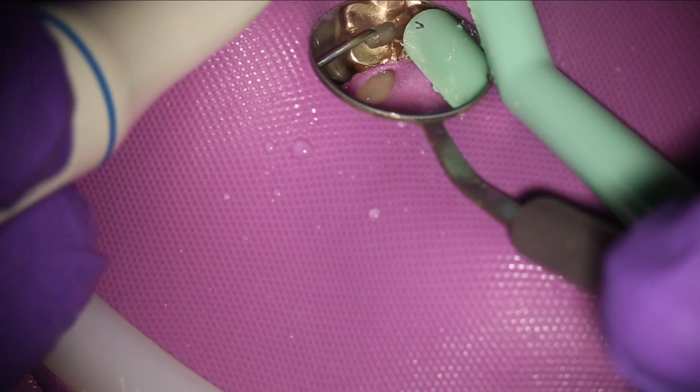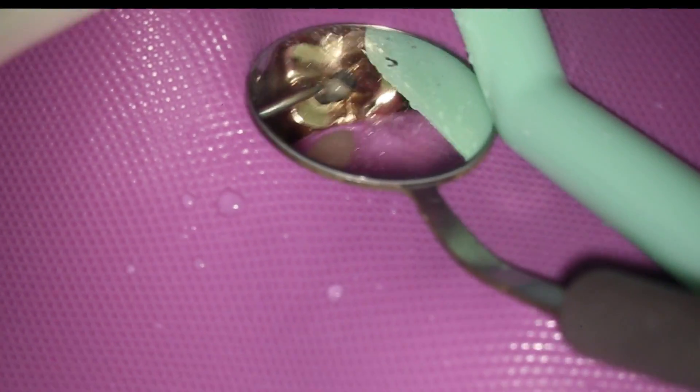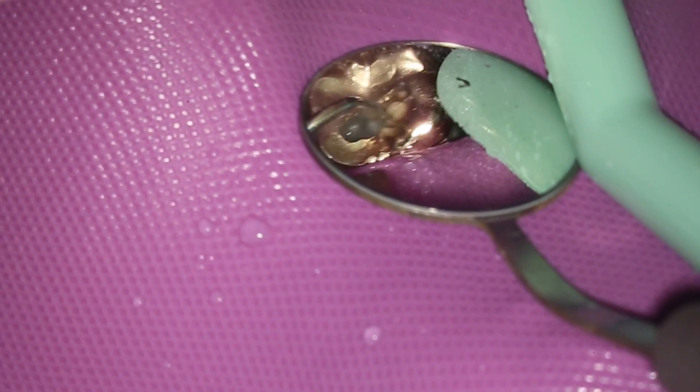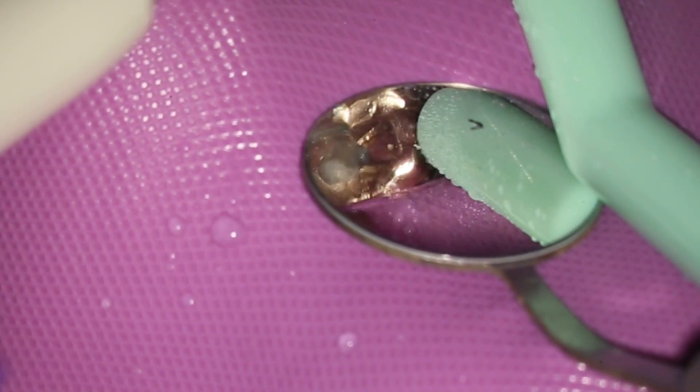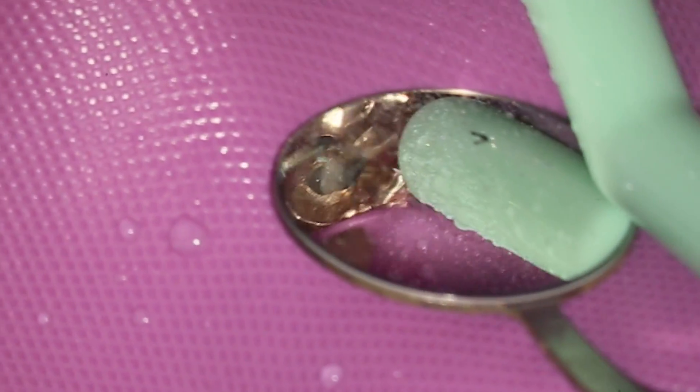I go in with the high speed and I just remove a little bit of the glass ionomer. And then I finish it, remove the rest of it with a workhorse one tip. I can blast out the apical part of the glass ionomer and take the cotton ball out at the same time without using a high speed or a drill. So that just comes out with a workhorse one.